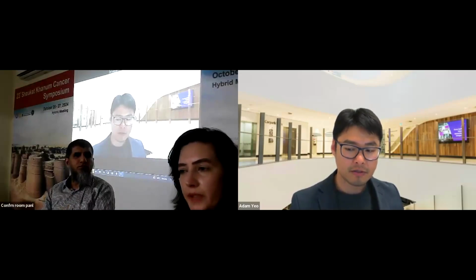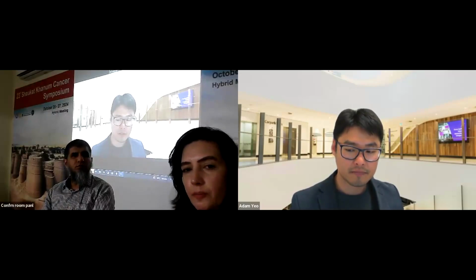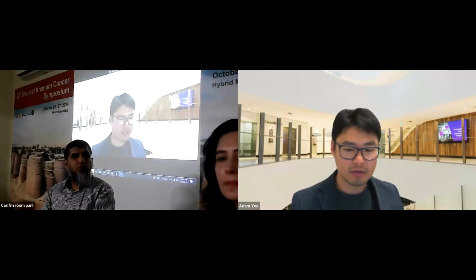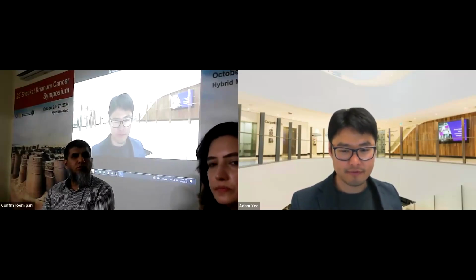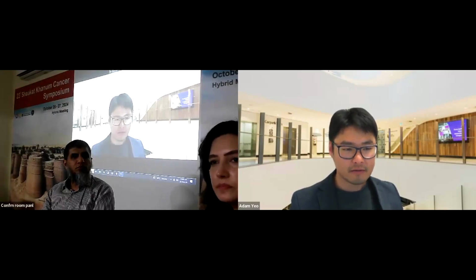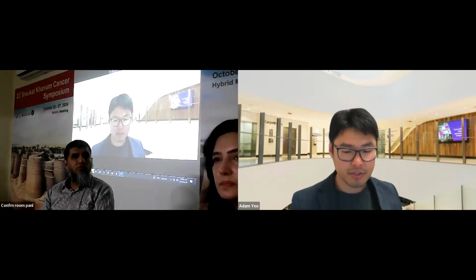So you're saying that 5 millimeter is not a hard stop for you. You can go higher than that as long as your dose constraints are met. Exactly. For a small lesion that moves 1.5 centimeter, we may just treat in free breathing with an ITV approach, because it's small. If it's a larger lesion, or a central lesion close to the heart and bronchial tree, even with small motion, we try gating or some other motion management.